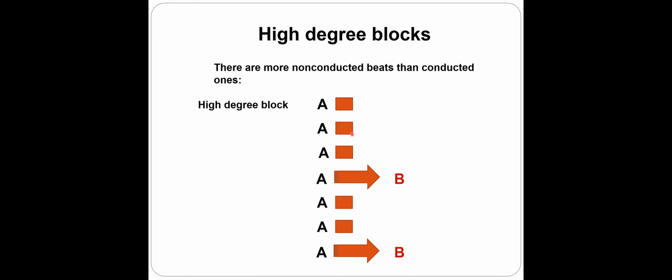And this way, we have a lower pacemaker center that can fire. So in this area, when we have no conduction, the patient's life relies on the escape rhythm. And sometimes, however, the beat gets through. This is why we have different types of beats. This is what we will discuss later.